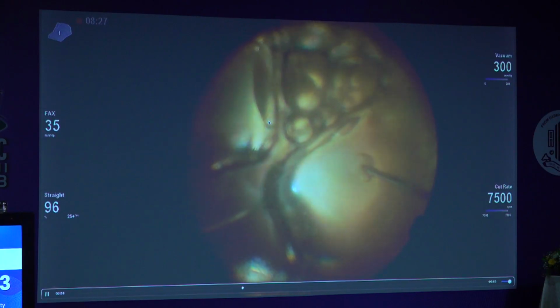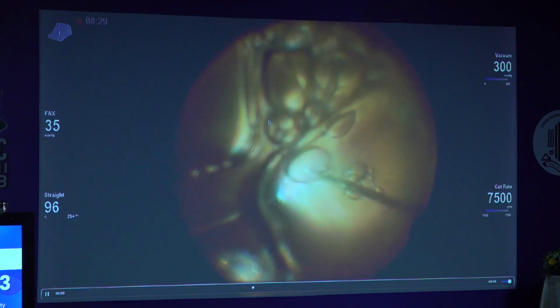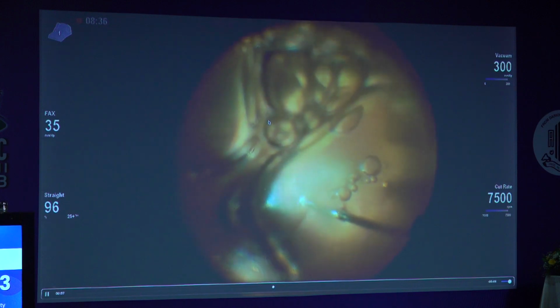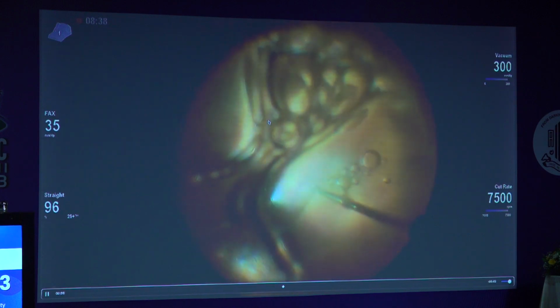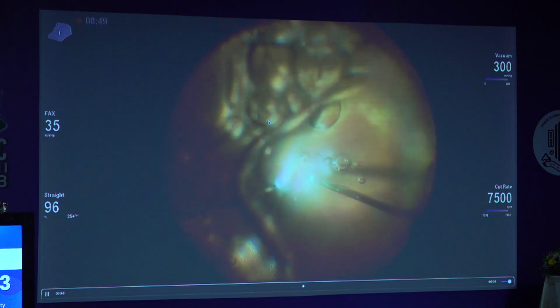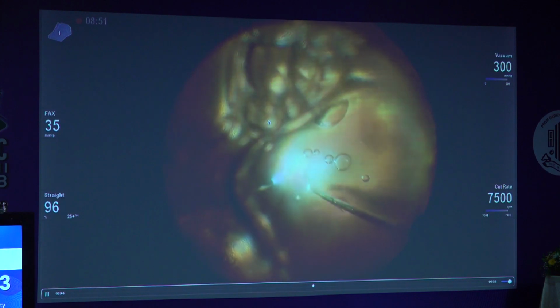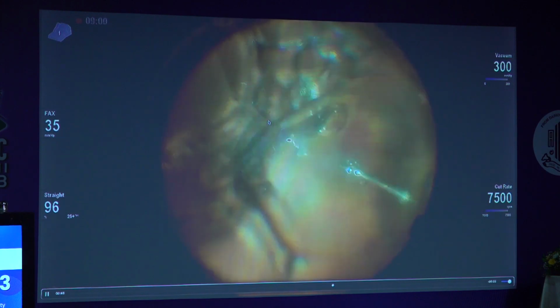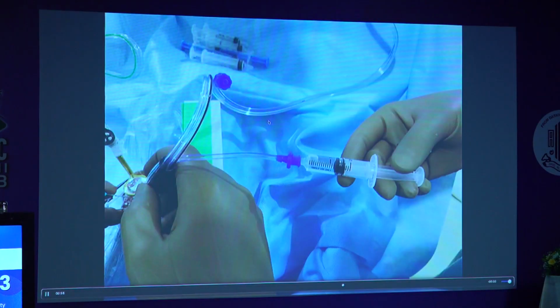Approximately 2.5 to 3 cc of vitreous can be taken under the air, and you have to do it slowly. You take samples from the anterior vitreous, mid vitreous, and the posterior vitreous, and label it and send it that way. This is vitreous biopsy.